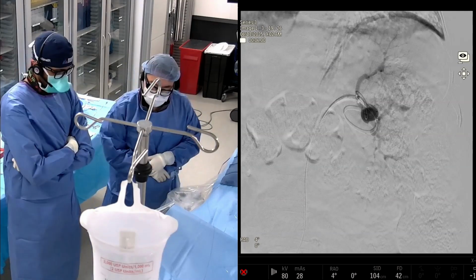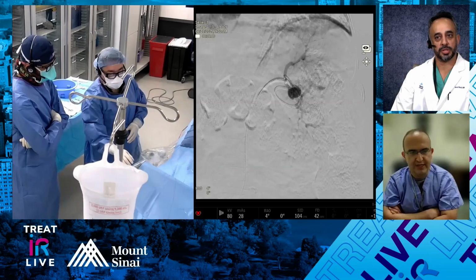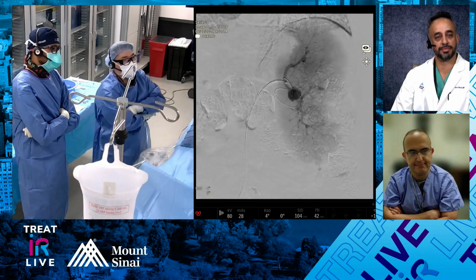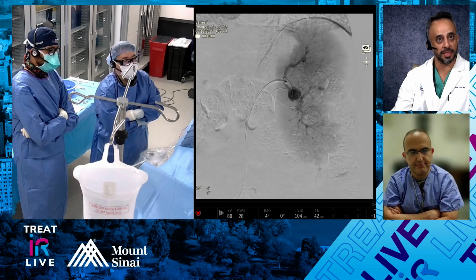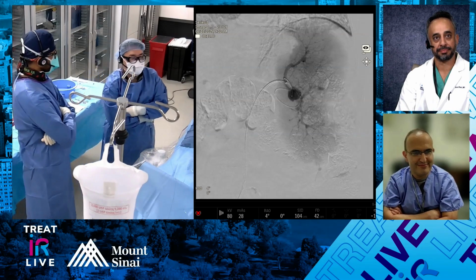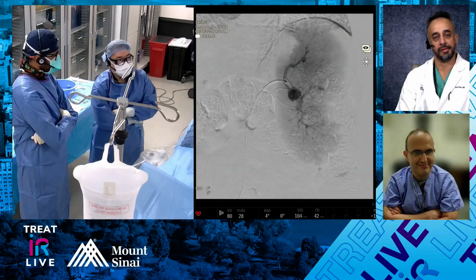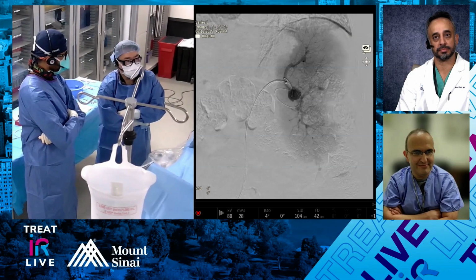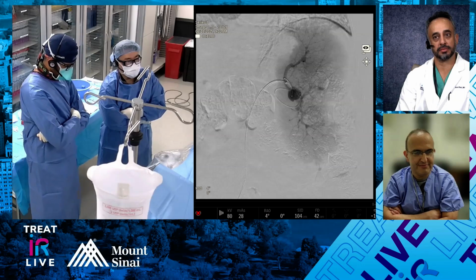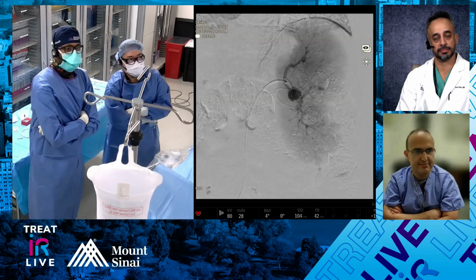Yeah, so given how distal it is, we've all had this thought: should we try to do a stent-assisted coil or put in a covered stent to preserve the distal flow? So what are your thoughts on that? And correct me if I'm wrong, Rahul, I mean, you might be first author. I don't remember, but our group published our experience on splenic artery aneurysm embolizations, and we might have one of the largest series that's been published. I don't think any of them were stent-assisted coiling.